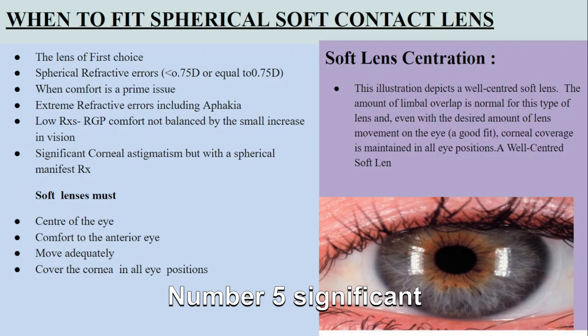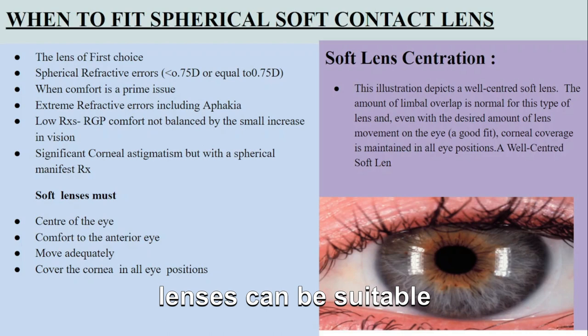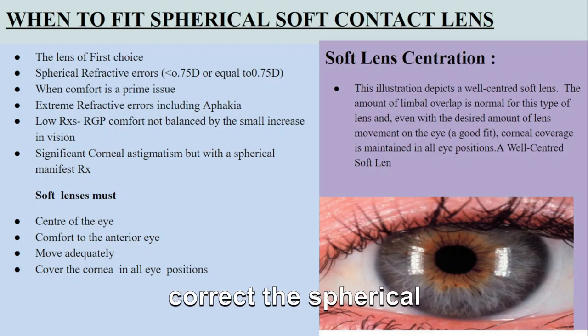Number 5. Significant corneal astigmatism with a spherical manifest Rx. If you have significant corneal astigmatism, spherical soft contact lenses can be a suitable tool. These lenses can correct the spherical component of the prescription while allowing the cornea to provide some astigmatic correction.